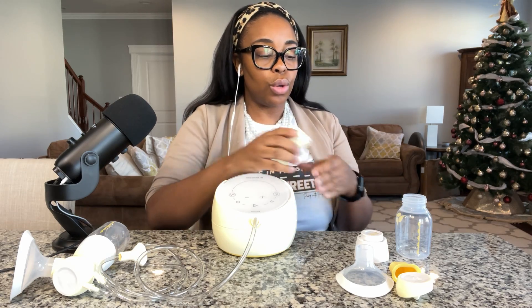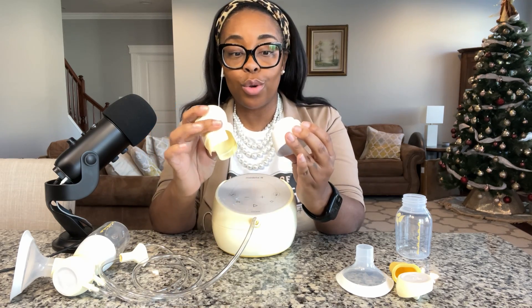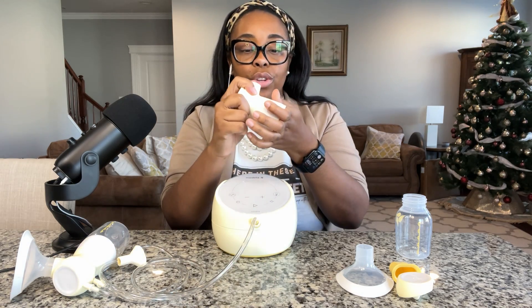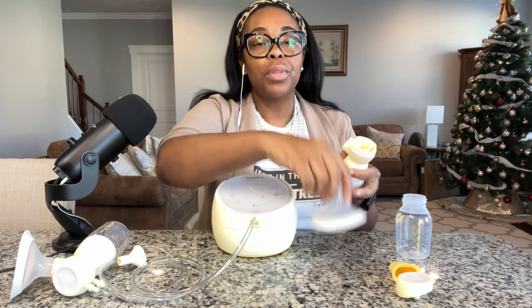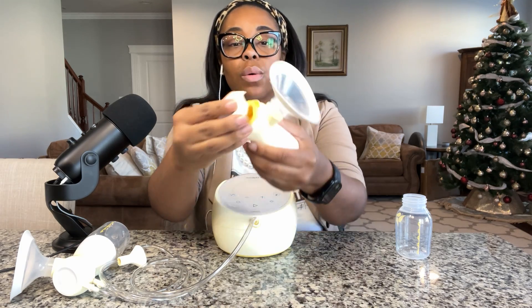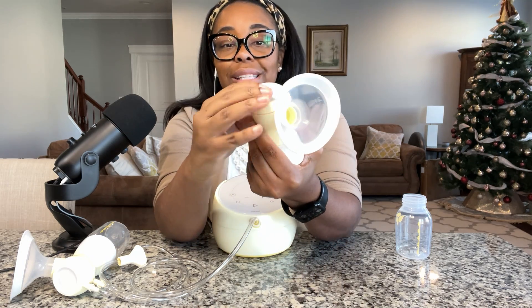Let's talk through all the parts. First, the flange connector — I want to point out a couple of things. This can come apart, so you really want to make sure you pull it apart when you go to wash it. There's a piece in the middle that sits here. You pop it in where it aligns perfectly. I'm using the 21mm flange. You put it on the membrane for the backflow protector, pop it inside, and then this piece aligns with the front, while the tubing piece goes toward the back, and you pop it in.